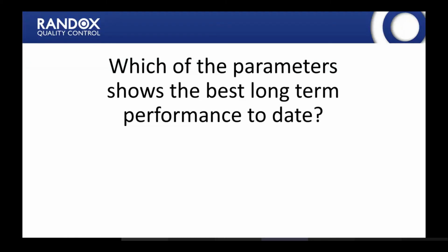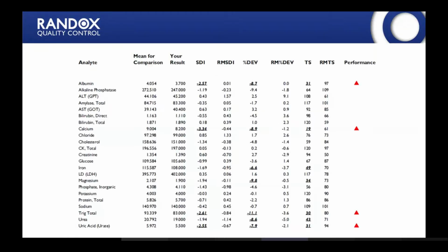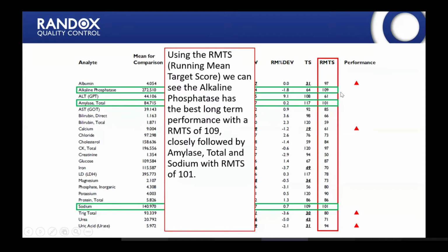So which of the parameters on this summary page shows the best long-term performance to date? We've just said we want to look at our running mean target score, because this is the one that's always a positive value and is going to give us our best indication. So we want to have a look down the list and see which of these values is the highest. And if I come back up to the top, it's alkaline phosphatase that has the highest.